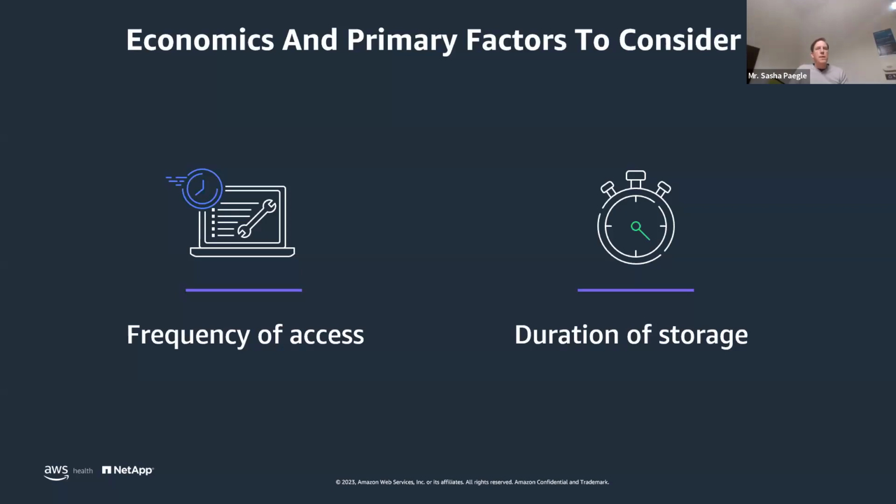One thing to point out is that for a long time, object storage wasn't a viable option beyond, say, disaster recovery to support imaging applications, partly because the properties of object storage were such that, at the time, retrieving an image or a set of images or a study exceeded the SLA of a particular imaging application. It was tens and tens of milliseconds, which wasn't satisfactory.